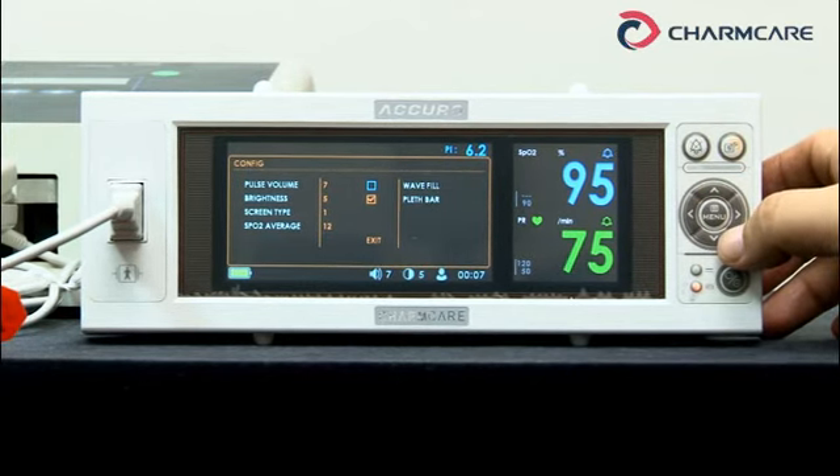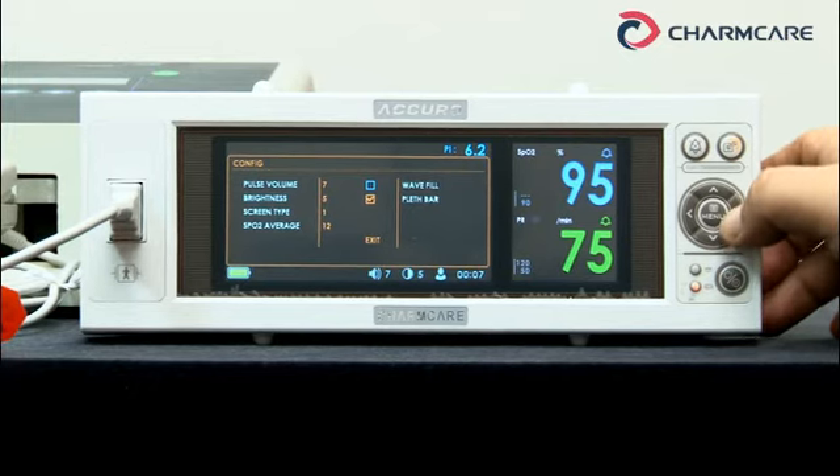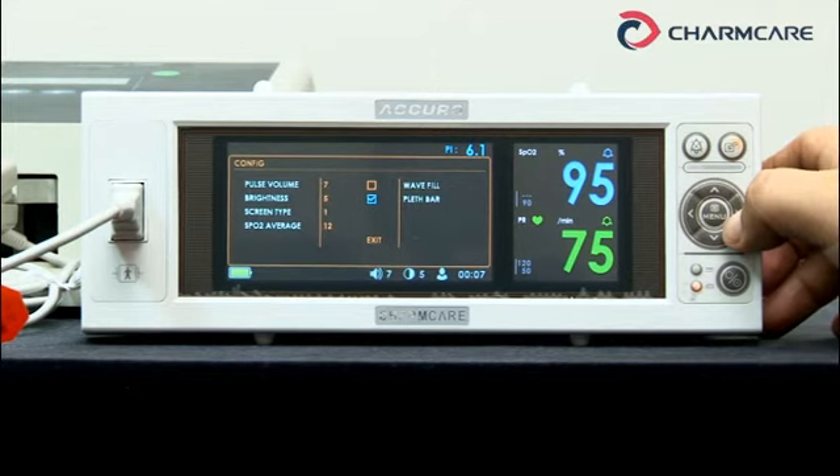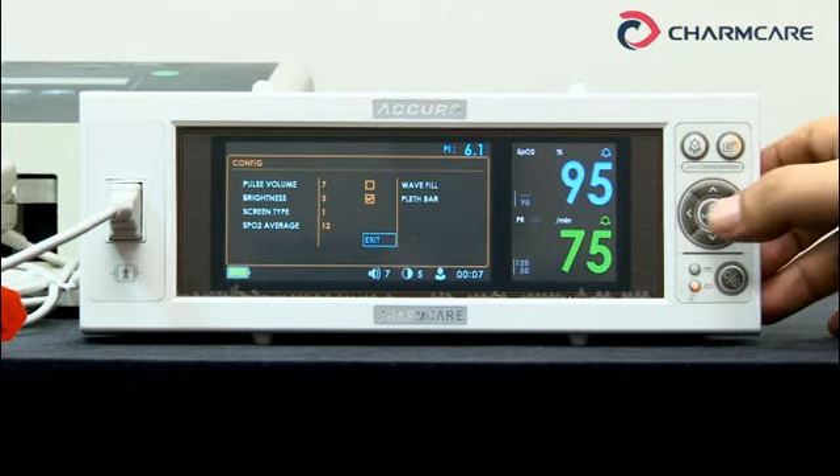Wave fill — wave display: off or on. Pleth bar — level bar: off or on. Press menu to continue.